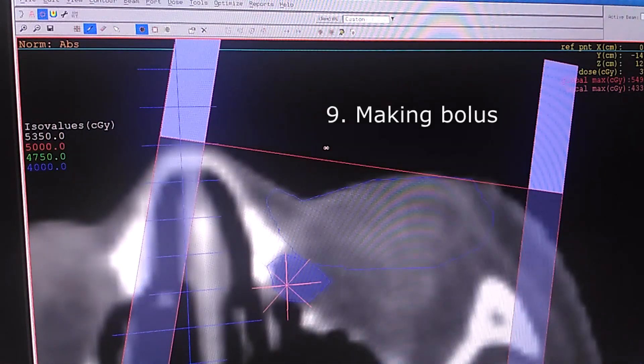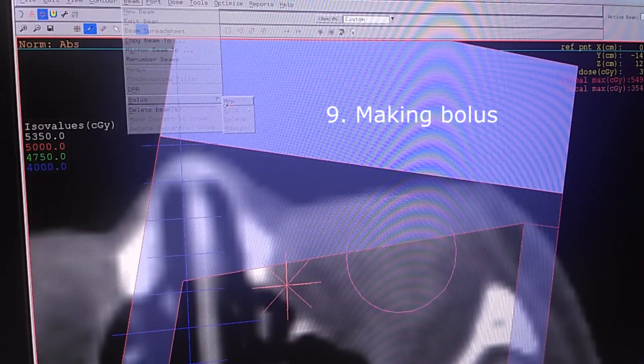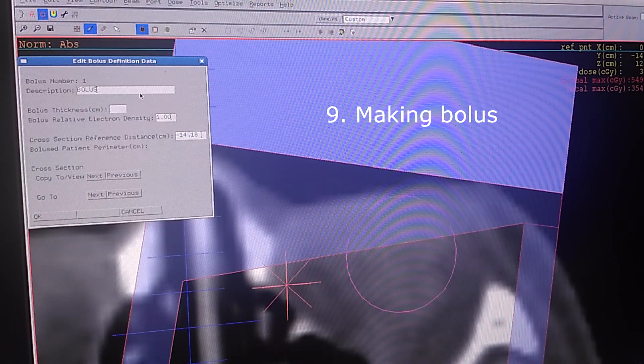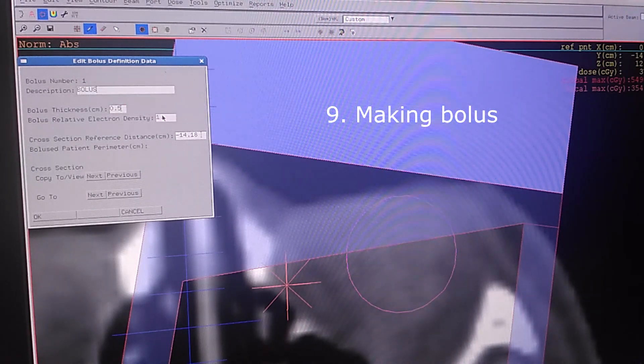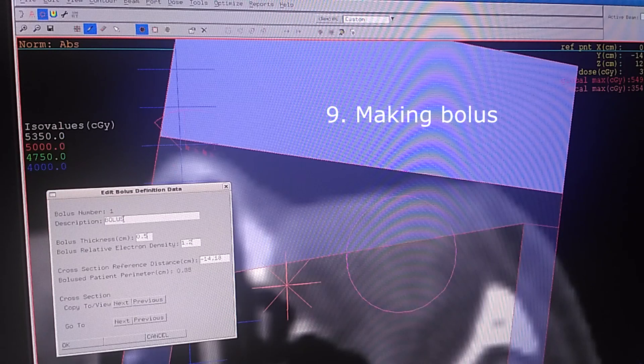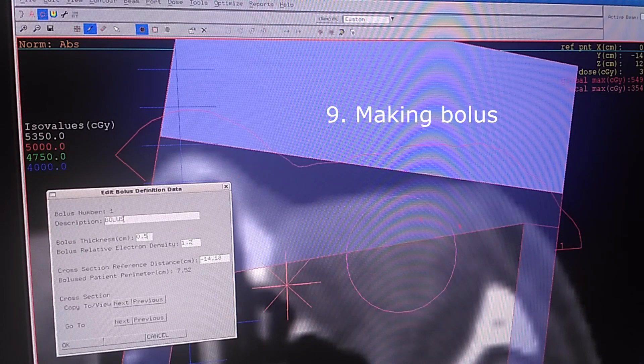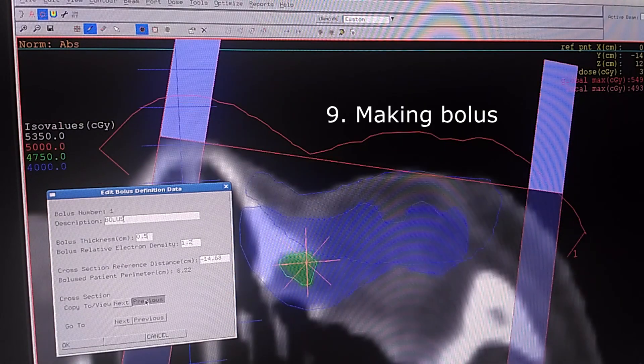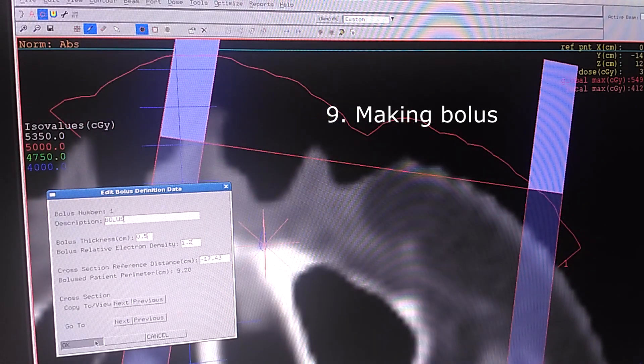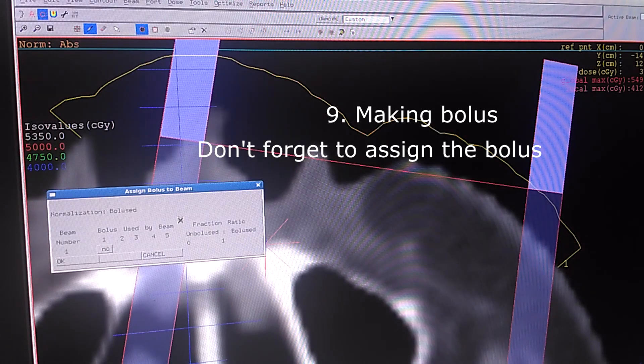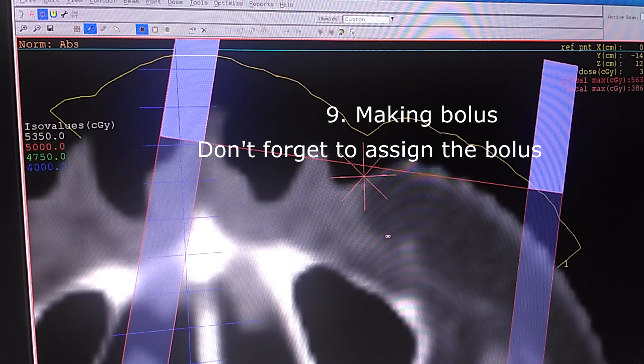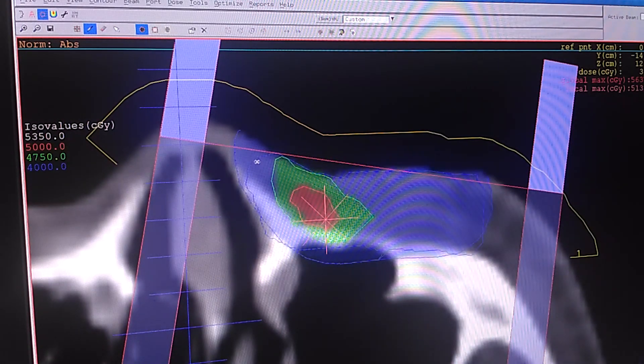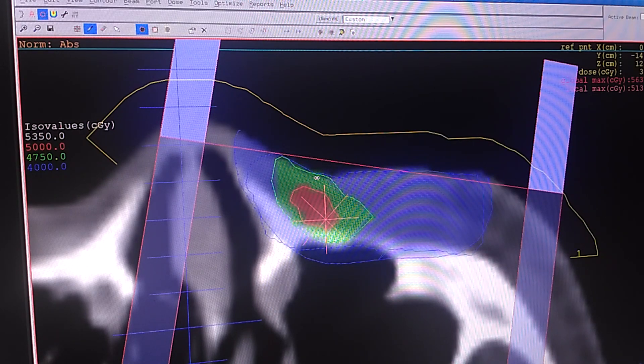I'm going to make bolus here. Click, click. And then OK and I'm going to assign it and it will be automatically calculating. As you can see the dose is going upper into the skin which is better than before.